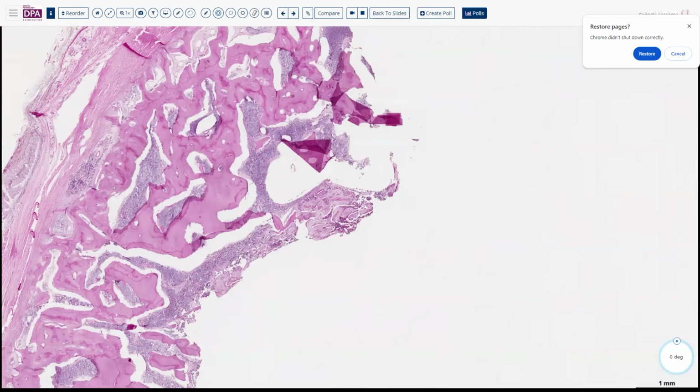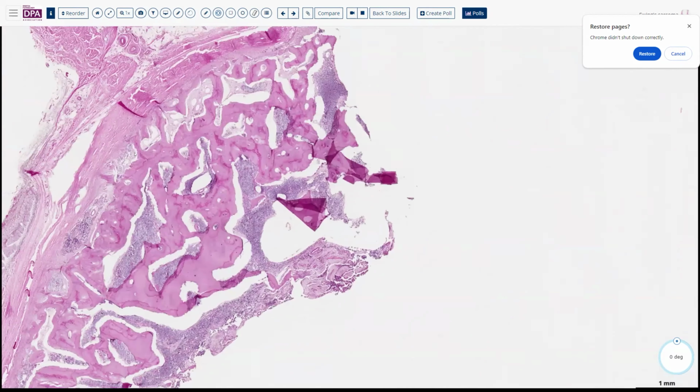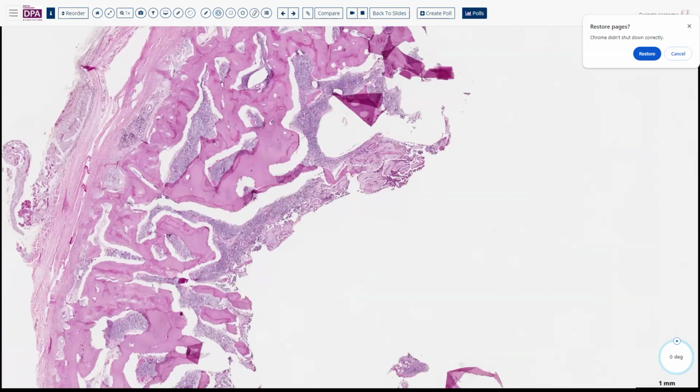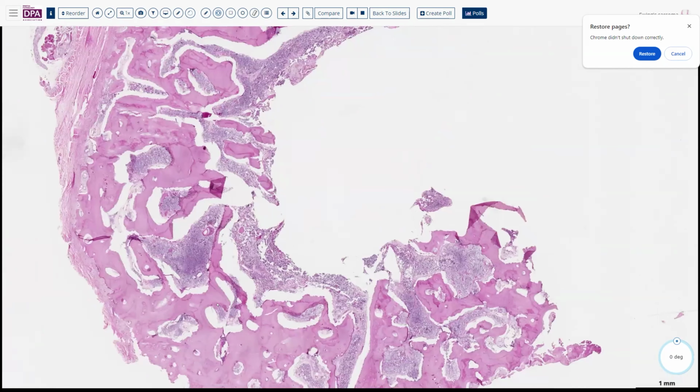This is one of those classic tumors that has a very moth-eaten pattern of bone destruction. It just grows so rapidly between the bony lamellae. It can begin to raise the periosteum, as you see it's done here. And here you see these beginning elevation marks of the periosteum. So the tumor is expanding the periosteum and causing the bone to be somewhat distorted and to have some new bone laid down. But mostly it's just eating its way through the marrow spaces in this tumor.